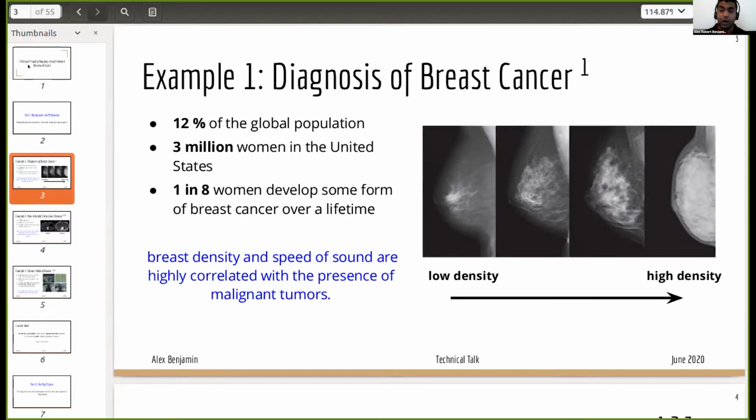So quick motivation on why we need three-dimensional property maps. So conventionally, ultrasound has been a 2D imaging modality. When you tend to get ultrasound images, they tend to be 2D images that are largely qualitative.